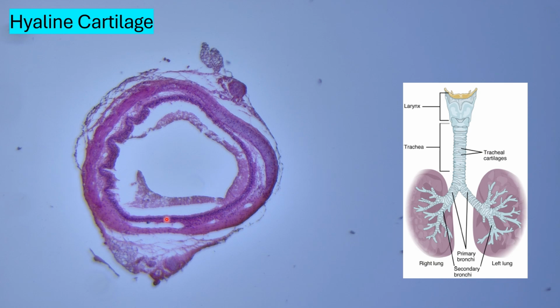So there are 3 different types of cartilage, with hyaline cartilage being the most abundant in humans, so we'll focus on that. Cartilage has a lot of functions such as protecting bones from abrasion inside of joints and distributing mechanical loads. Here we see it in the trachea, also known as the windpipe, where it provides structural support to prevent the trachea from collapsing. So it's pretty important since we need air to breathe. So it helps maintain the shape and keeps this airway open.